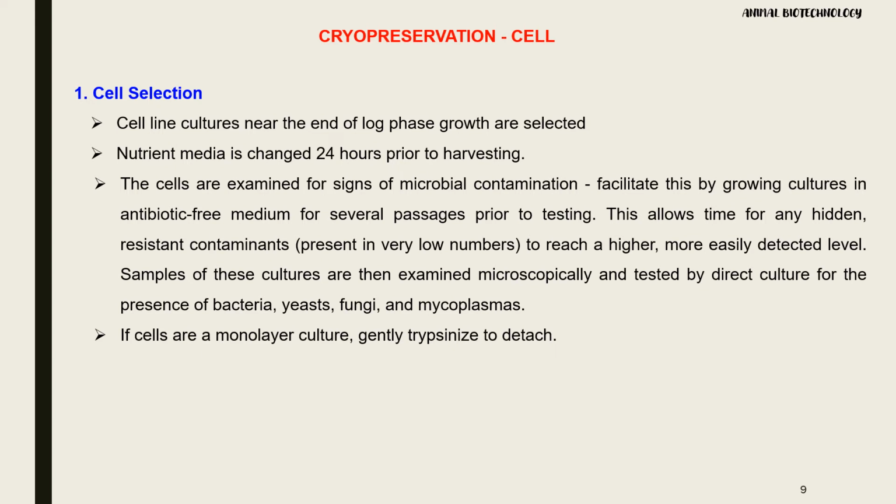The cells at the end of the log phase of growth are selected for cryopreservation. Prior to harvesting the cells, the nutrient media is changed.